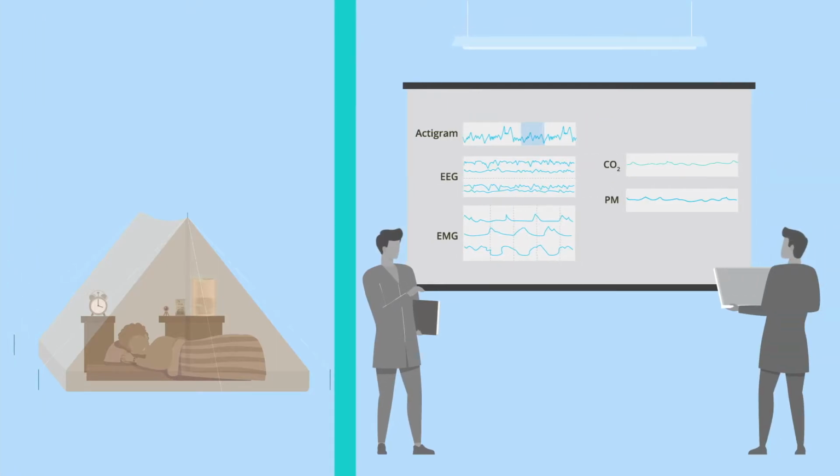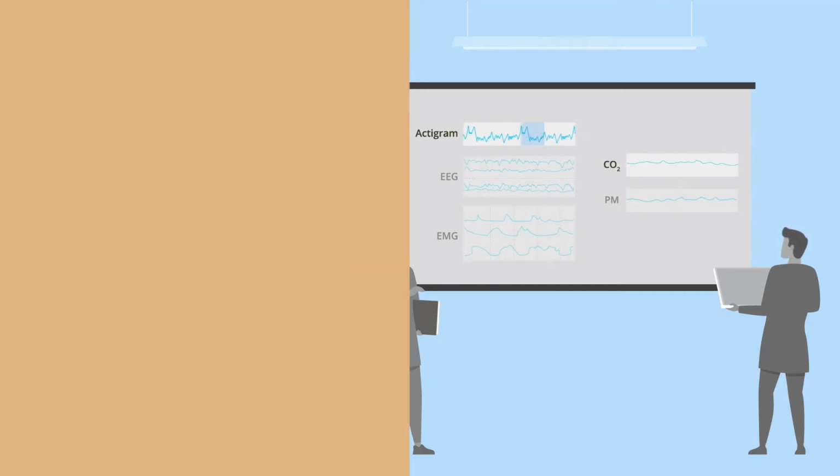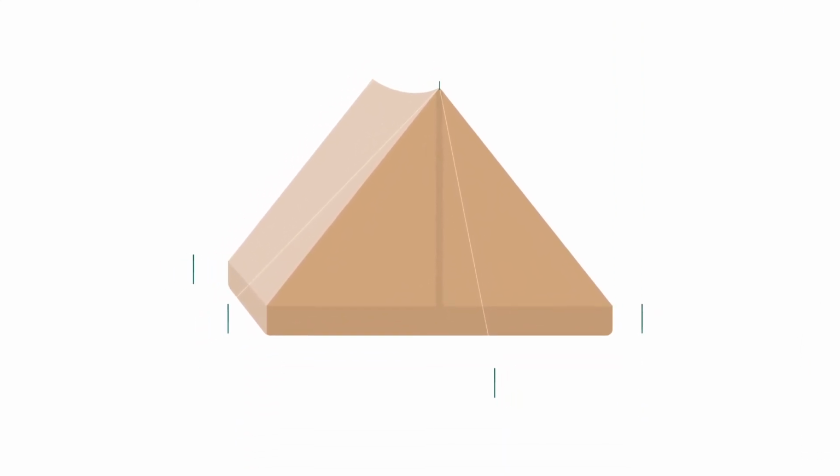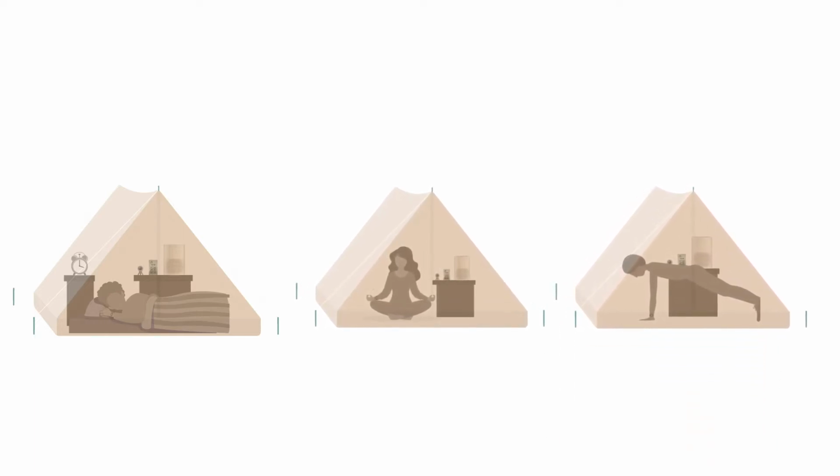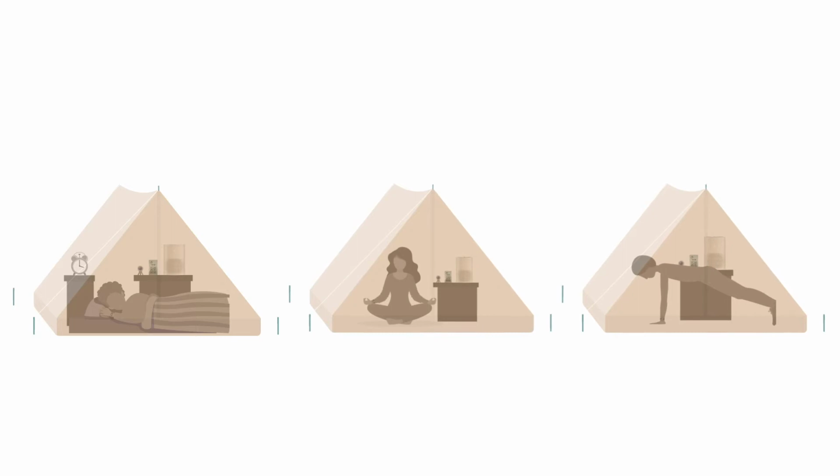We used our T-CUSP to remotely measure the electromyography, electroencephalography, and actigraphy signals of multiple subjects to explore the relationship between sleep and changes in air quality. We discovered that the subjects' activity levels correlated with the amount of carbon dioxide inside the tent. Therefore, although originally designed for sleep monitoring experiments, a person's metabolism and exercise efficiency can also be derived from the variables measured by our system.